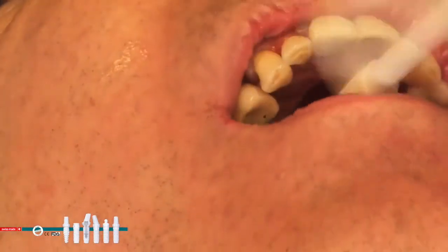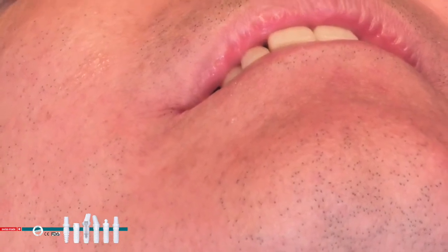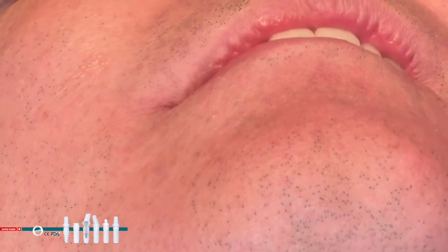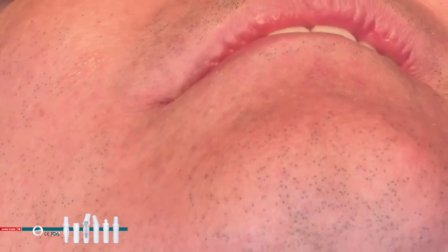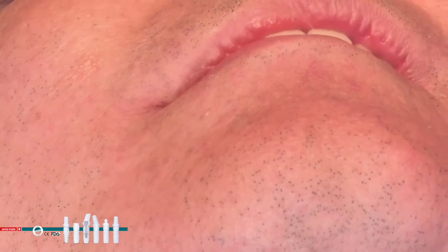Remember, there's 2-3 millimeters of gingival height, so we go down to 12 or a little bit past 12 millimeters on the markings of the drill. So you go about a half millimeter to a millimeter below the implant length into the bone, correct? Well, for a 10 millimeter implant, the marking on the drill is at 11. So I go to 11 and a half, close to 12. Yeah. But you have to take into account the 2 millimeter gingival height because it's flapless. Okay.